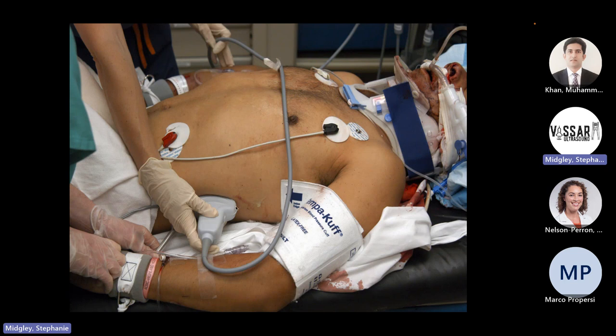This one, you are actually a little bit higher up. So typically you want to start, I almost start near the armpit, because if I start in the lung, it's very easy to identify, because you're going to see ribs and you're going to see lung sliding and you'll see A lines. If you start too low, you're going to end up in bowel. And bowel is just sort of bright white scattered everywhere, and you don't really know if you need to move up or down or left or right. So if I start too high, at least I know as I move down, something will start to come into my view. And then typically you want to be a bit lower because your kidney and spleen live more posterior.